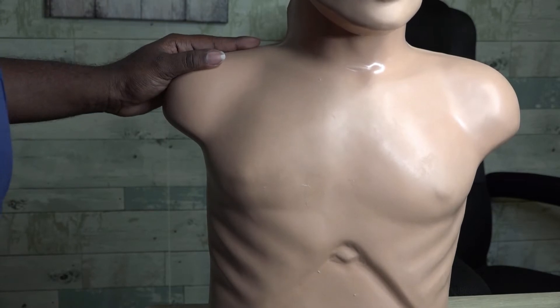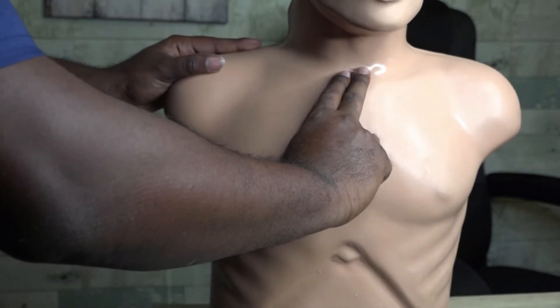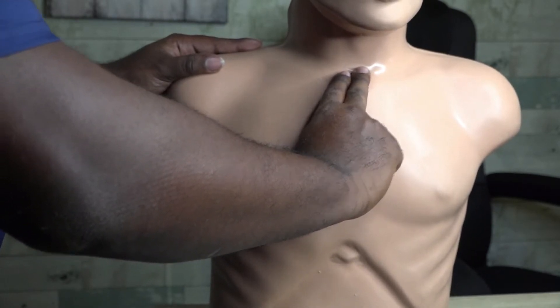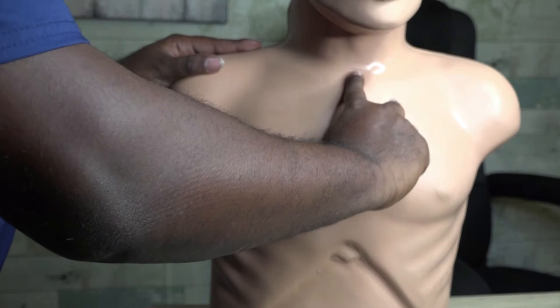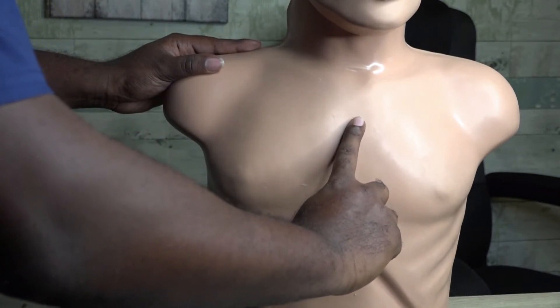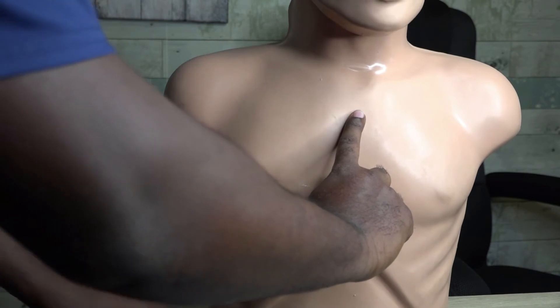Before we start, we need to know our anatomical locations and landmarks so we can find those intercostal spaces. I'm going to start up at the sternal notch — that's right between the clavicles. Then I'll take my finger and go down the sternum to what is called the angle of Louis, which is where we'll begin placing our EKG leads.